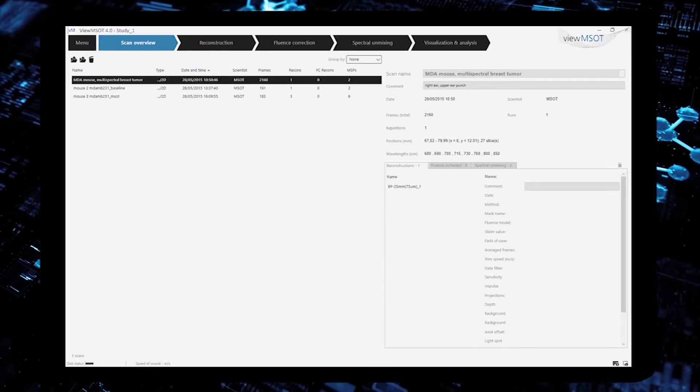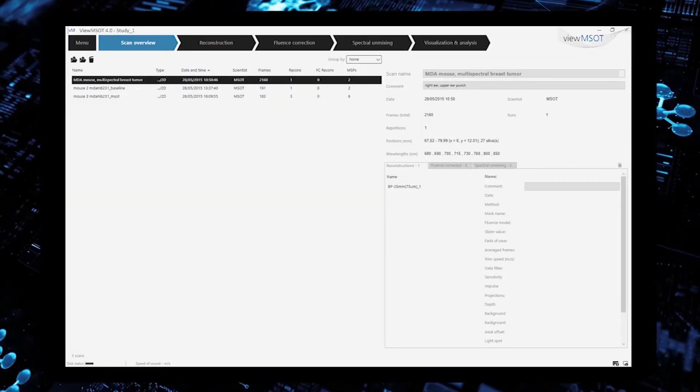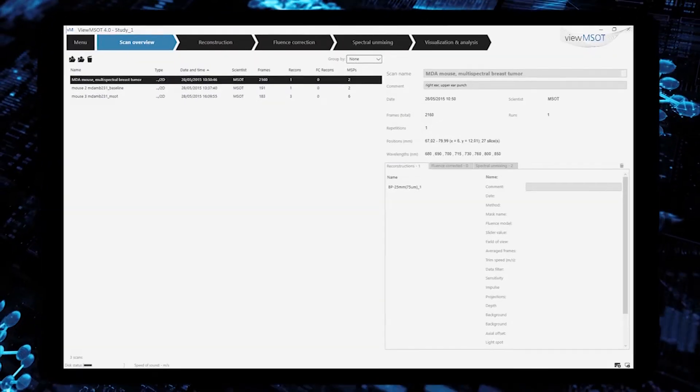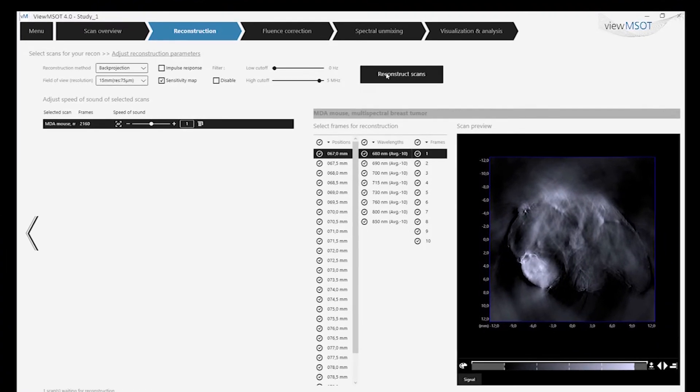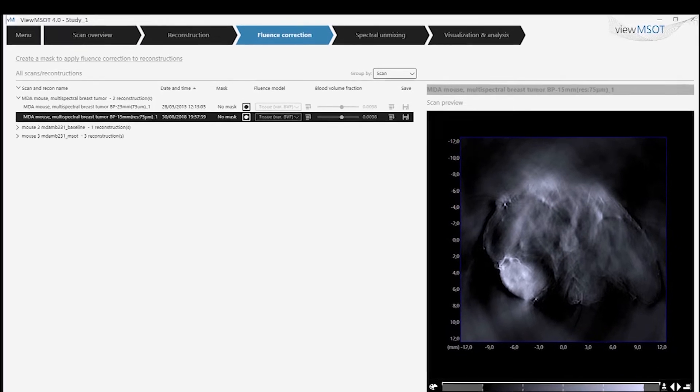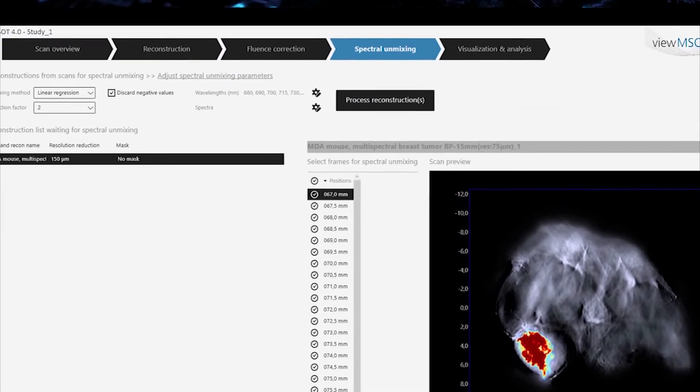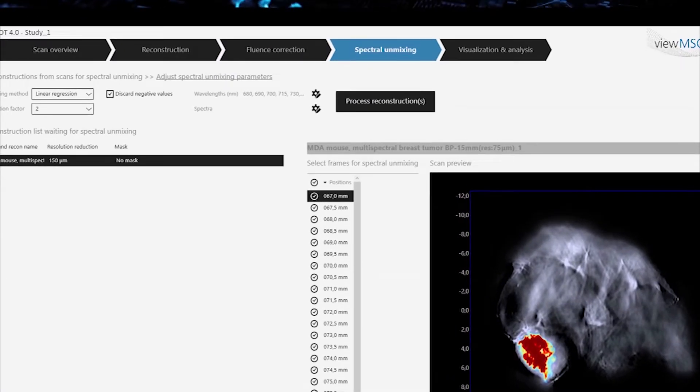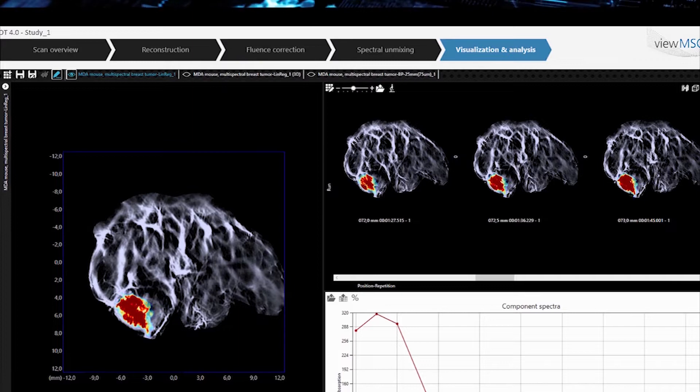VIEW MSOT covers the entire image processing chain, from reconstruction, fluence correction, spectral unmixing, to visualization and analysis.